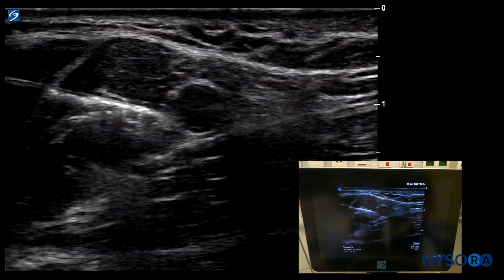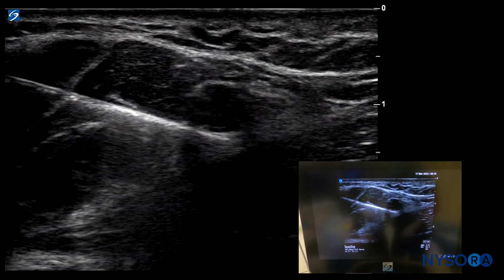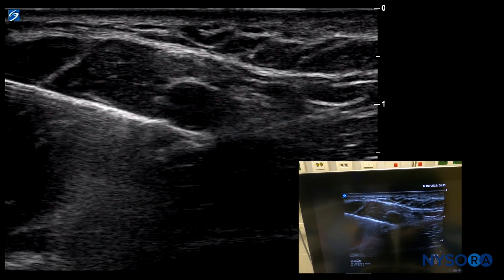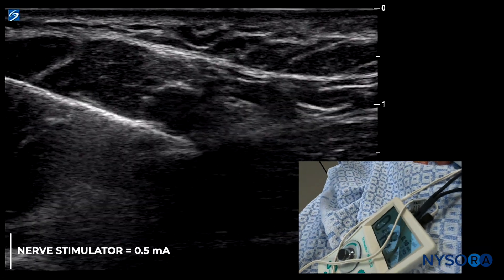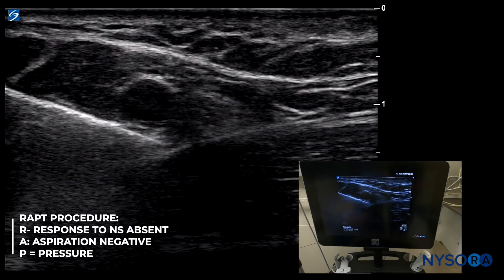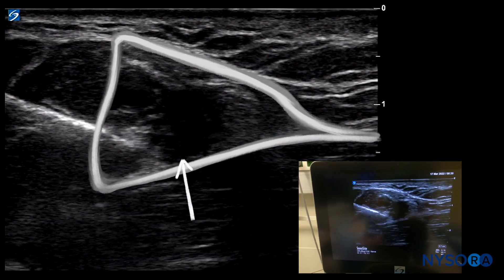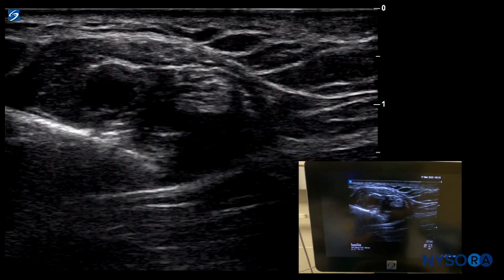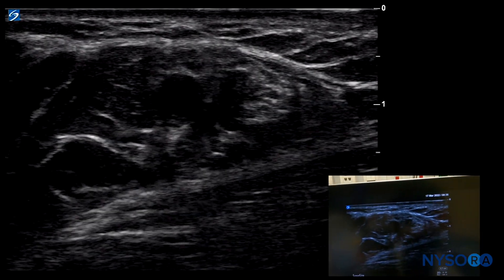We're going to avoid the musculocutaneous nerve and pass underneath the axillary artery. There was a pop — you can see the whole structure twisted with the artery and its adventitia, and once we passed it there was a little click. We check there is no motor response to nerve stimulation; the nerve stimulator is set at 0.5mA, aspiration is negative, and injection pressure is normal. As we start injecting, the local anesthetic is distributing nicely inside the axillary brachial plexus sheath, displacing the radial nerve — eight milliliters injected.